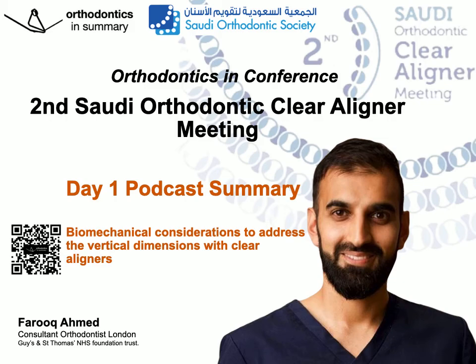Posterior intrusion he described as being something which is advantageous with aligners, and two uses of it. One for expansion, so when we are expanding in the upper arch and developing it to prevent the palatal cusp handing down, building in some intrusion to the upper posterior teeth. The second is for true intrusion, and he mentioned we've got to always account for the closed system of aligners. So if we are going to intrude posteriorly, we are likely to get anterior extrusion as well. He mentioned the attachments on the occlusal surface are really key to this process.